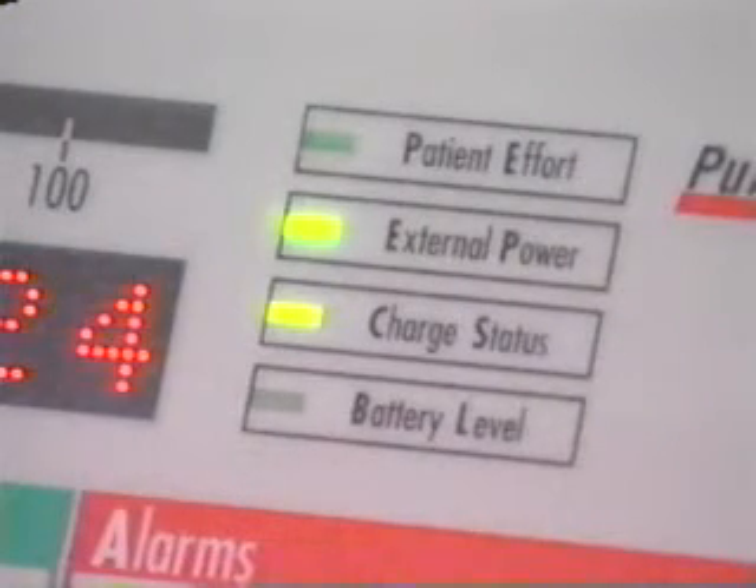Verify that the external power LED shows green or yellow. While the ventilator is connected to the external battery, the internal battery is being continuously charged.